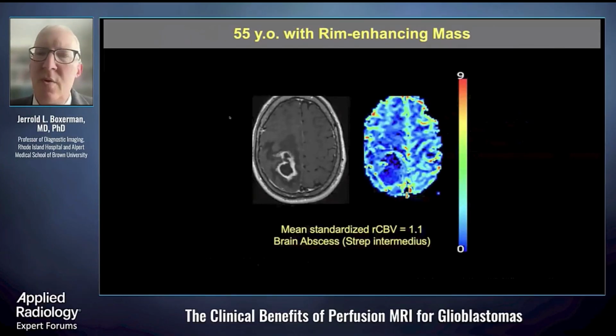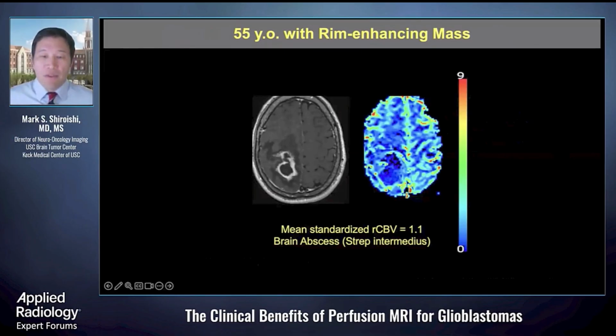Now, I think this is a case that Mark submitted for a review. So, Mark, maybe you want to chime in about another example of CBV application to tumor versus non-tumor etiology. Yeah, thanks, Jerry. So this is a case of ours.